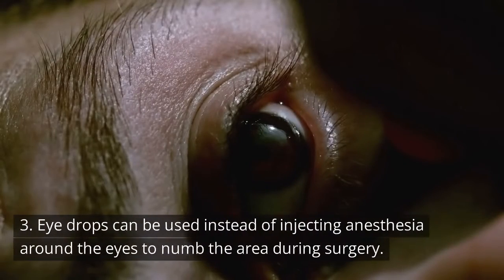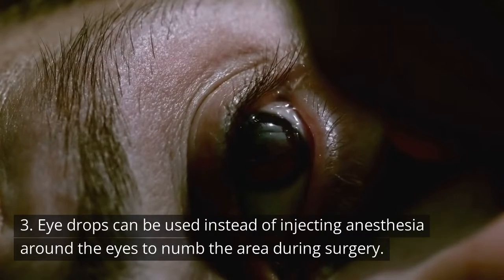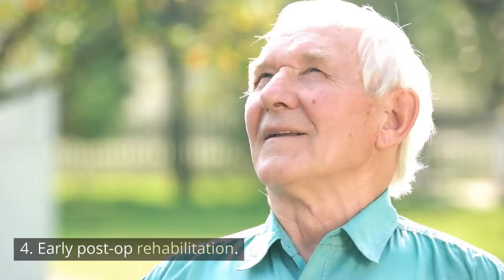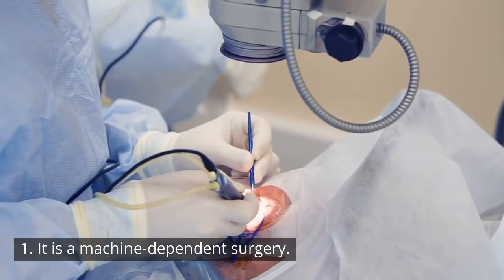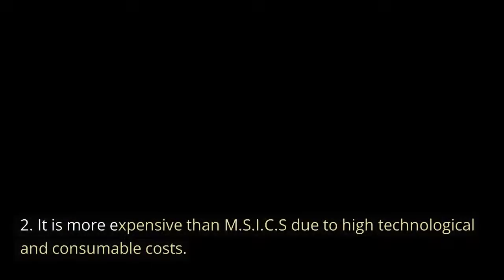3. Eye drops can be used instead of injecting anesthesia around the eyes to numb the area during surgery. 4. Early post-op rehabilitation. Disadvantages: 1. It is a machine-dependent surgery. 2. It is more expensive than MSICS due to high technological and consumable costs.